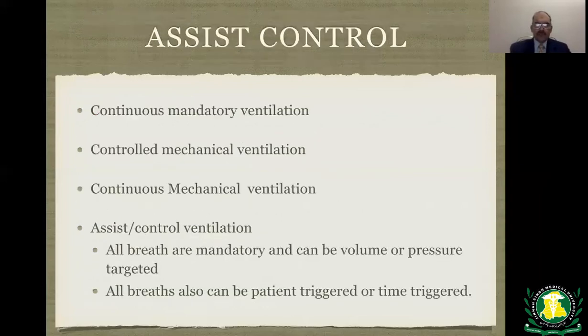Assist control. It is also known as continuous mandatory ventilation, controlled mechanical ventilation, or continuous mechanical ventilation. In this mode, all breaths are mandatory and can be volume or pressure targeted. And all breaths can be patient triggered or time triggered.